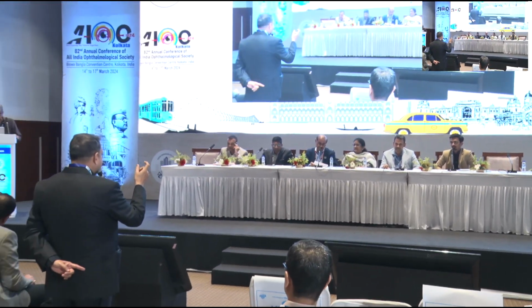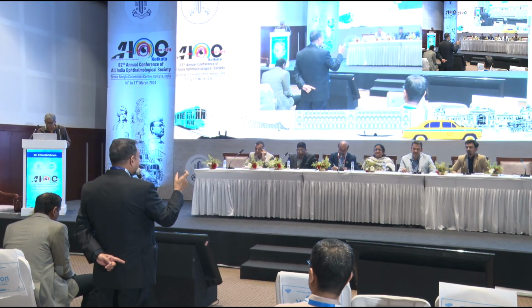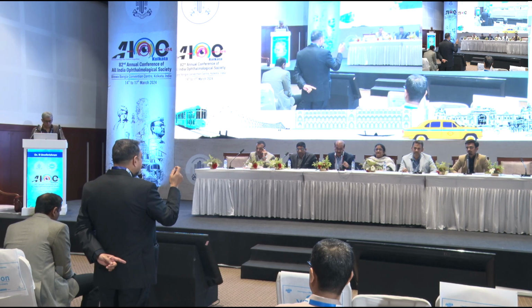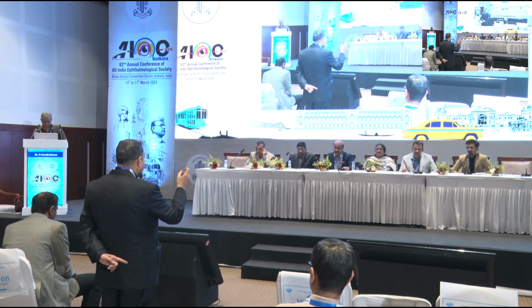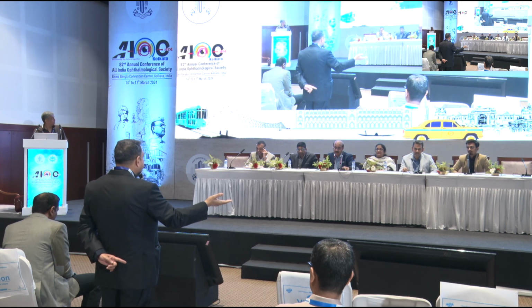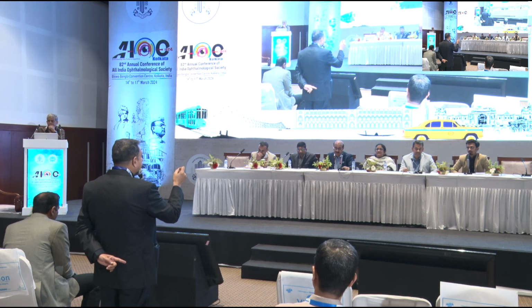No. See, the very point of OCTA in recurrence is that you are capturing it earlier than the fluid production. You have that window of opportunity to prevent further damage. So I believe in future, TAE is going to change to OCTA-guided TAE. That is, at every visit before you do your treat and extend, your OCTA is going to be the tool to see whether the recurrence has started, even when you don't have fluid. It is going to refine your TAE to a great degree.